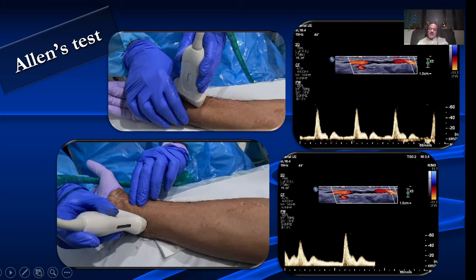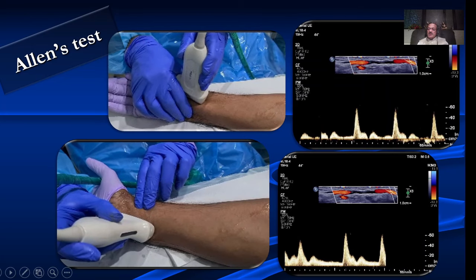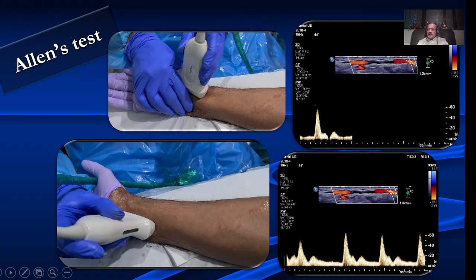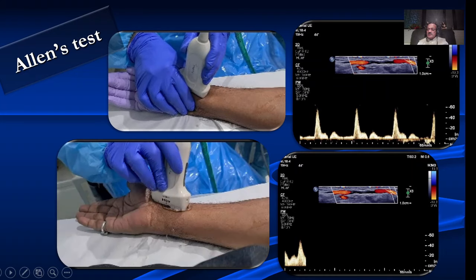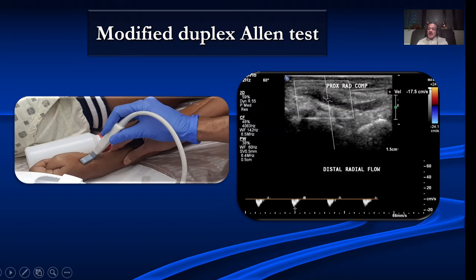Here we are doing the Allen's test — looking at the radial artery, compressing the ulnar artery, and looking for an increase in velocity. Then looking at the ulnar artery, compressing the radial artery, and again looking for an increase in velocity. There is also a modified duplex Allen's test where we keep a small-footed probe in the snuff box, look at the radial artery there, and compress the proximal radial artery. If the palmar arch is patent, we get reversal of flow coming from the other artery — confirming the palmar arch is patent.